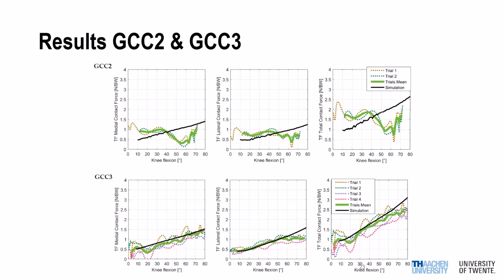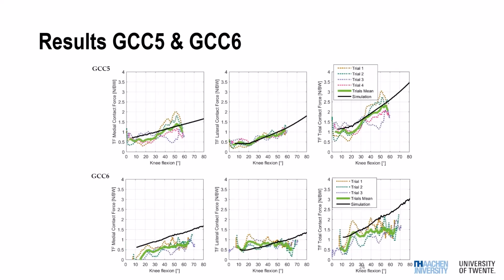But also what I would like to highlight here is the load curve of the experimental measurements, which I would like to address in a minute during the discussion. But first, let's take a look also at Grand Challenge Competition 5 and 6. For 5, we see that we can capture quite nicely, again, the in vivo forces. And for 6, the magnitude on the lateral side seems fine, but then the total contact force is also a bit off again.